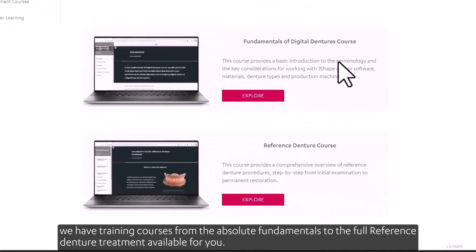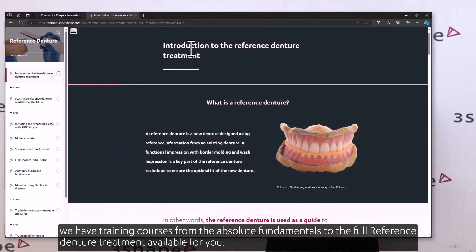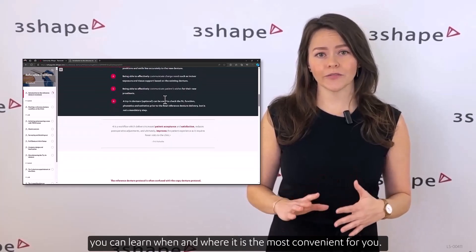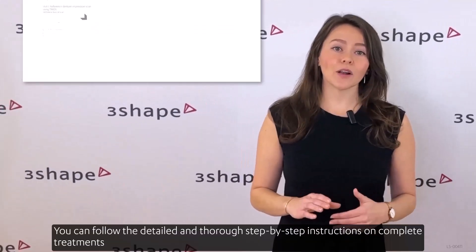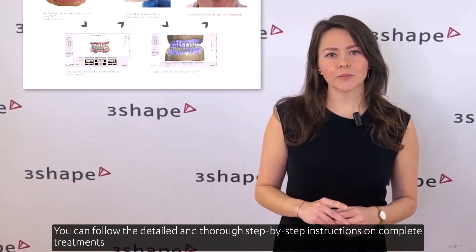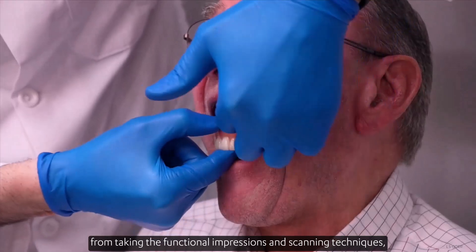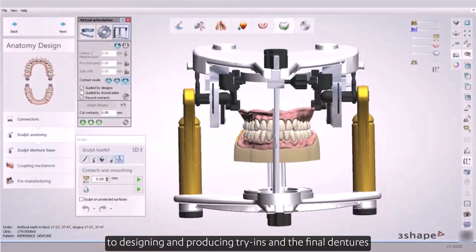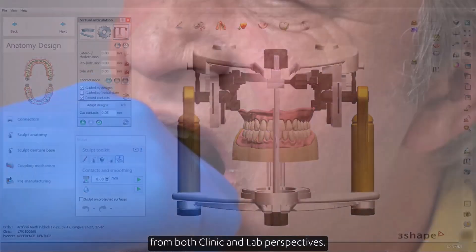The best thing is you can learn when and where it is most convenient for you. You can follow detailed and thorough step-by-step instructions on complete treatments — from taking the functional impression and scanning techniques, to designing and producing try-ins and the final dentures, from both clinic and lab perspectives.